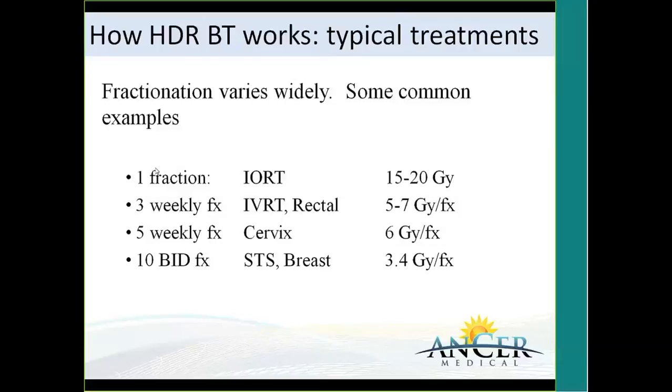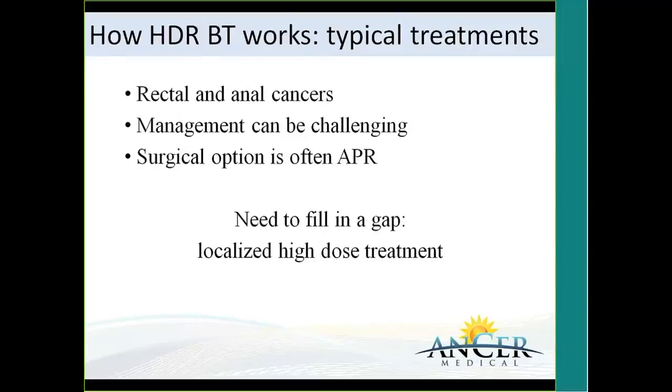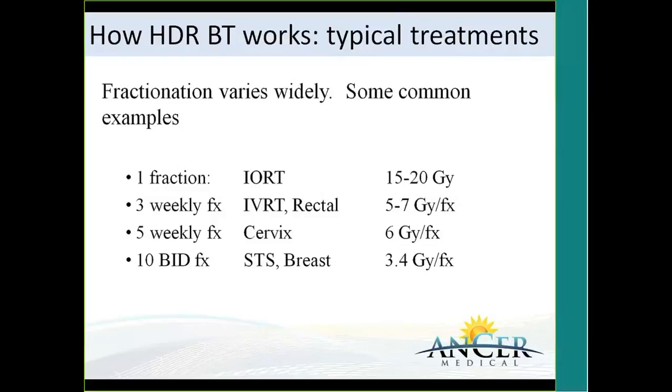Having done some research on HDR in general, and now listening to your presentation, it appears that using the afterloader catheters and delivering the iridium source, you're able to much better pinpoint the treatment of the radiation to the affected site, whereas a beam of radiation would have a more difficult time localizing the treatment to that site in the fashion that HDR does.